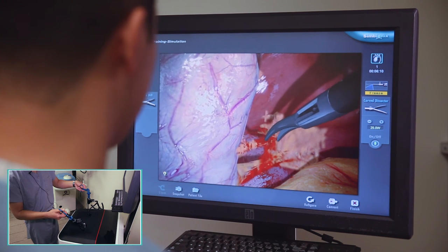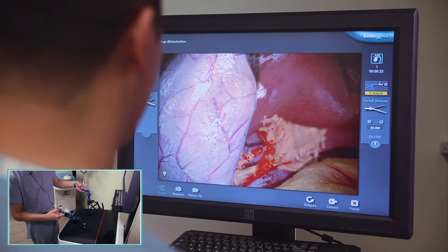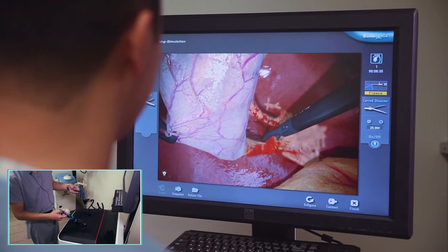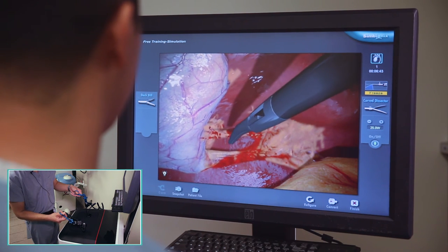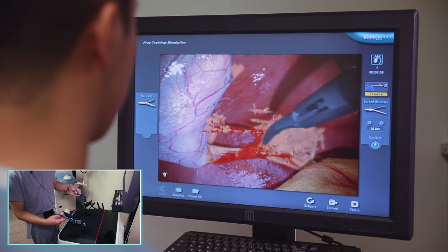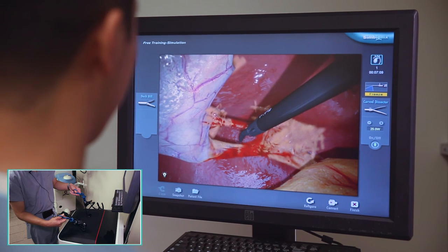The cystic artery, however, is much more fragile than the cystic duct, so you have to be a little bit careful when trying to take these adhesions off. I'm constantly making sure that I apply the right amount of counter traction with my left hand. To quote Dr. Andy Chu, surgery is all about traction and counter traction. At this point, I've established what I consider to be a pretty good critical view of safety. I have two tubular structures here and here, headed straight into the gallbladder. I see both structures going straight into the gallbladder, and I see the free edge of liver straight behind it.